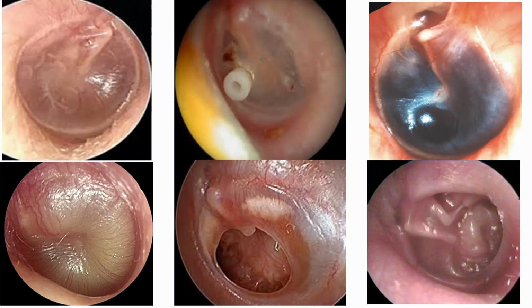So first we'll see the raised one. As you see, if the external canal volume is raised, it means that there is perforation in the tympanic membrane. And why is ECV raised? That is the external canal volume, because now the volumes of the middle ear and external canal are combined, and now the two spaces' volume will be more than only the external auditory canal volume. So in perforation, ECV becomes ECV plus middle ear volume, while in an intact tympanic membrane, it's only the external canal volume.